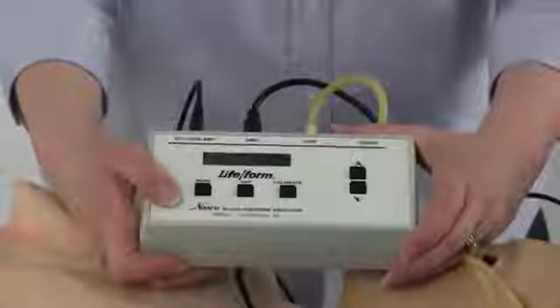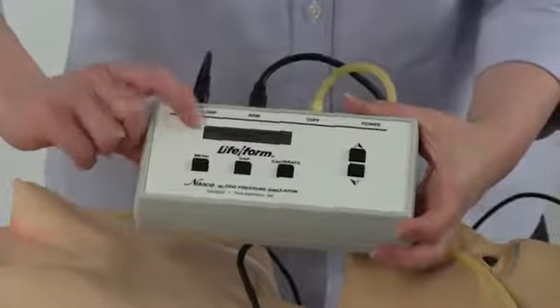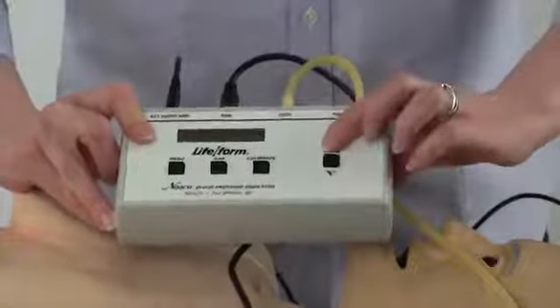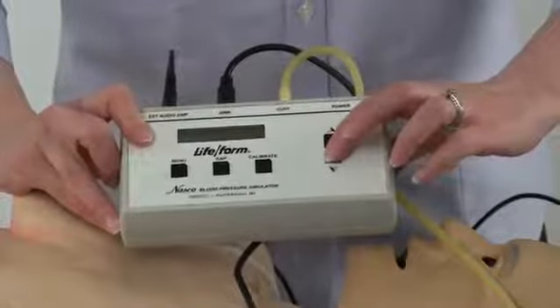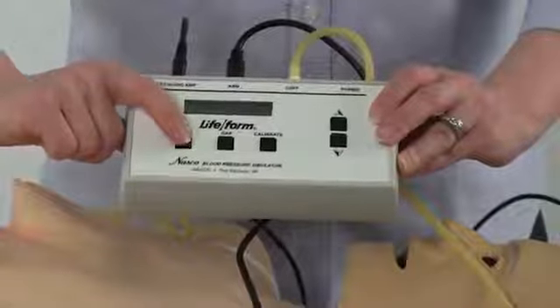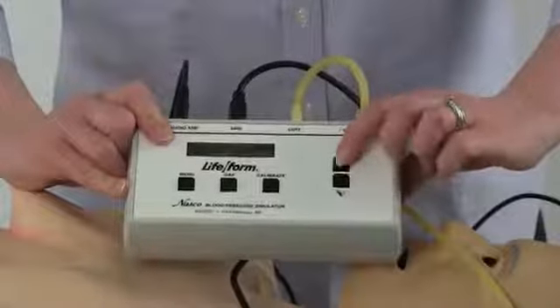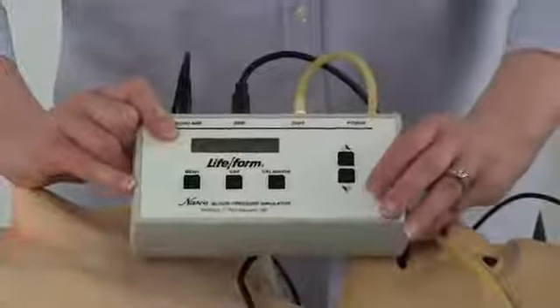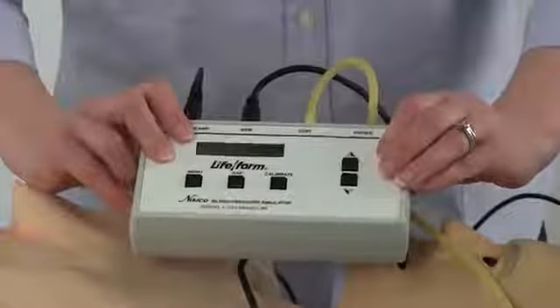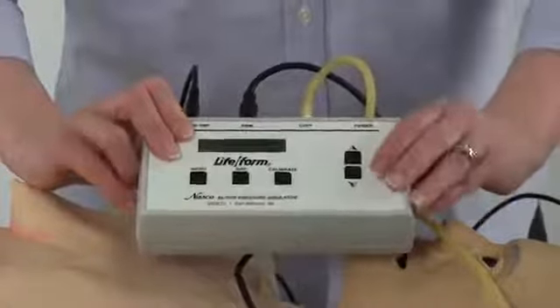To select a different blood pressure, simply press the menu button. The first menu that comes up is the set systolic. Using the arrow keys, you can increase or decrease the systolic rate. Pressing the menu a second time brings you to the diastolic menu. Again, using the arrow keys, set the diastolic rate up or down. Pressing the menu button a third time will give you the heart rate setting. Again, using the arrow keys, select the heart rate you choose.